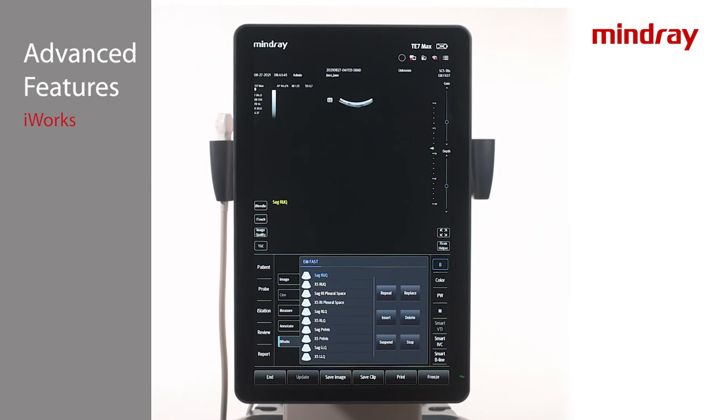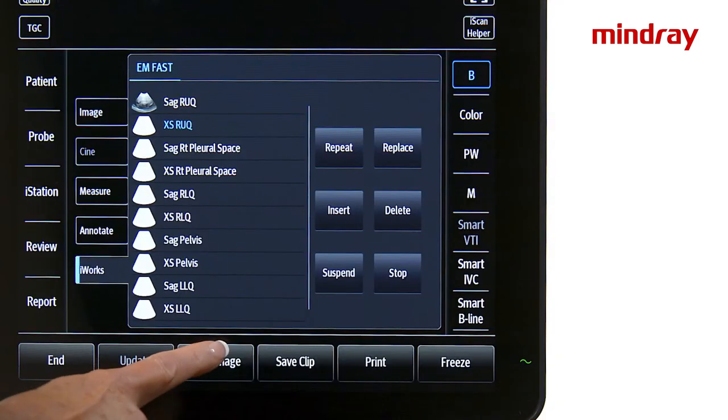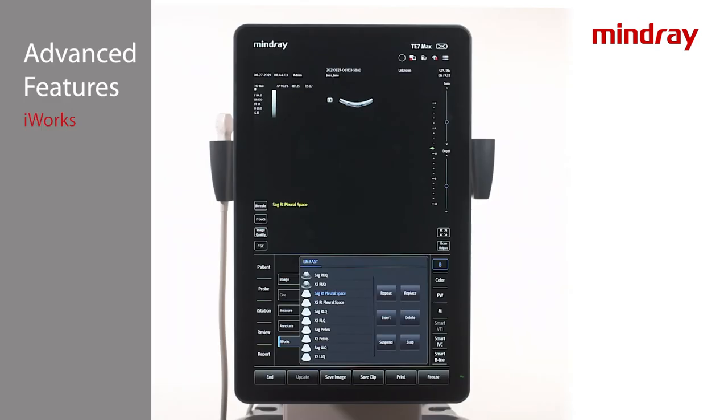An application specialist can help build custom protocols to desired specifications. Once a protocol has begun, the views will be displayed at the bottom of the imaging screen, as well as any associated annotations. Obtain the view and tap Save or Save Clip to store. For views that activate different modes, require measurements, or activate dual, follow the prompts along the bottom of the imaging screen.